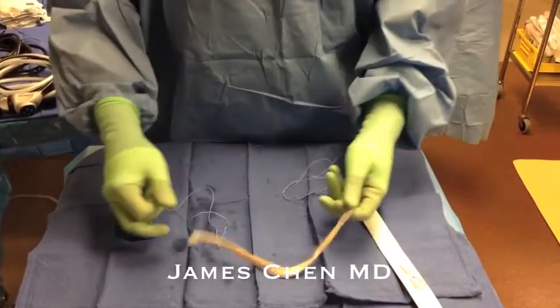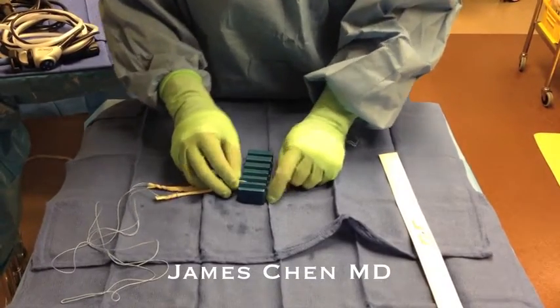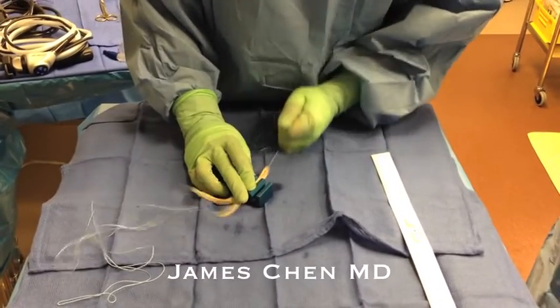Here I am pulling full tension. I am now going to run it through a sizer to get the diameter of the graft, so I know what diameter tunnel to drill.